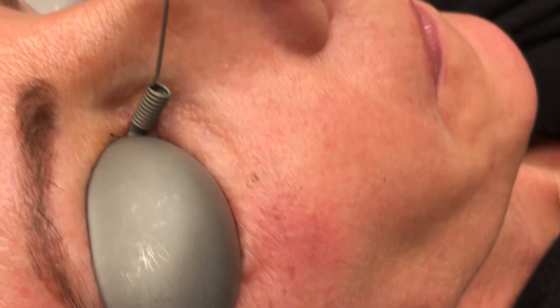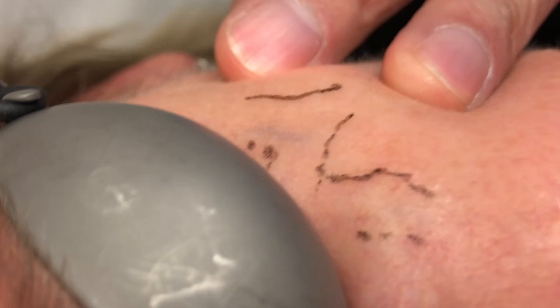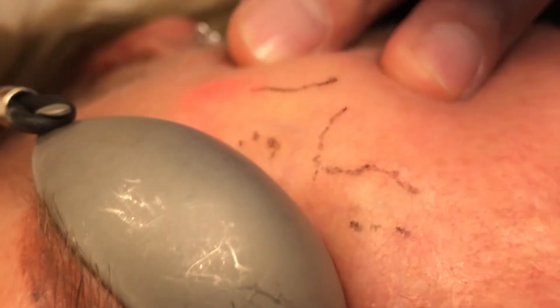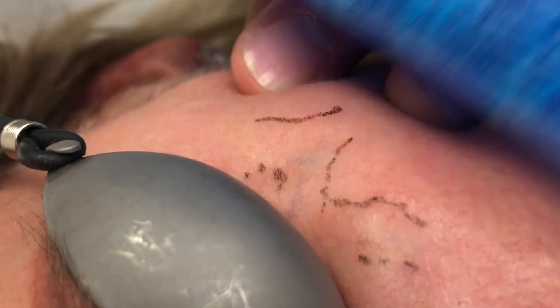I really find this to be quite an amazing treatment for vessels. If you take a look at this photo, in between the dark lines I've drawn — particularly above the two dots — you can see that blue vessel there. I'm going to show this in slow motion. When you see this, you'll see the aiming beam, and then just below the aiming beam, after we shoot the laser, you can see the blood vessels disappear, leaving normal skin underneath. The blue vessel in that spot is completely gone.